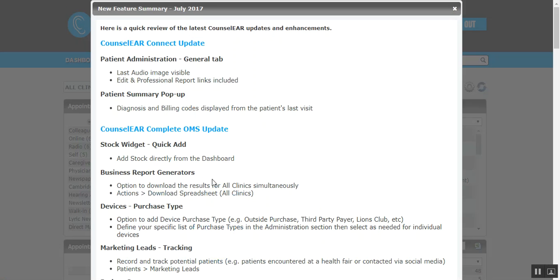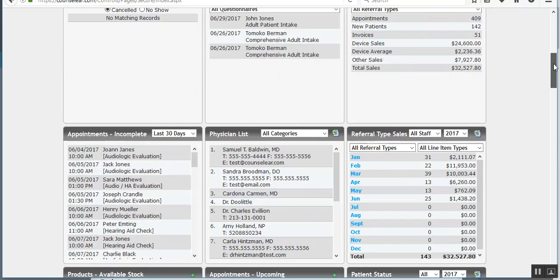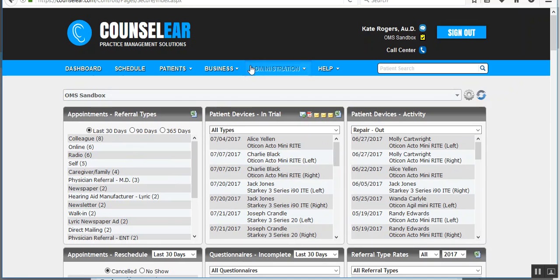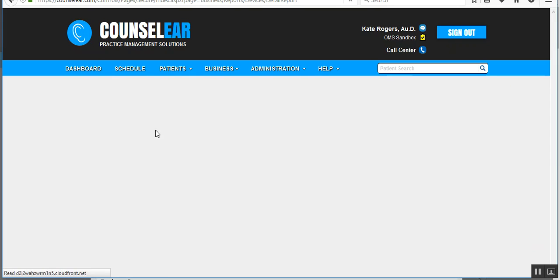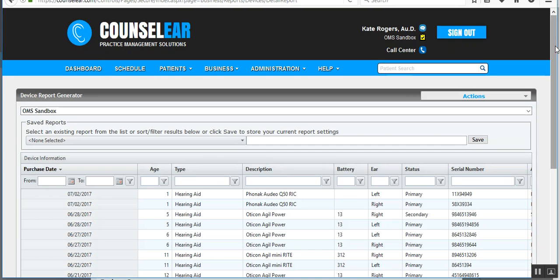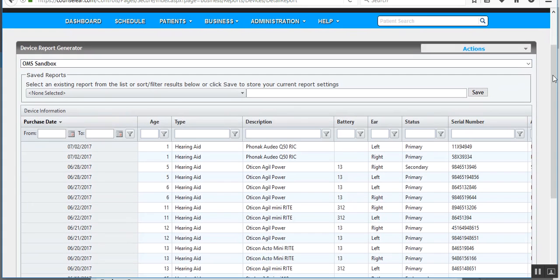There's the option to download the results for all clinics at once. So what happens here is within the business report generator, let's just take the device report generator. You can filter as needed. So here I'm looking at one clinic. If I needed to filter and say, I want to look at just, let's just say something here, Phonak devices.